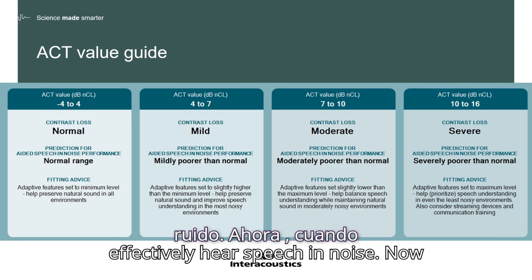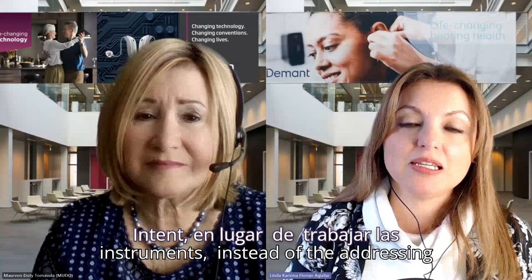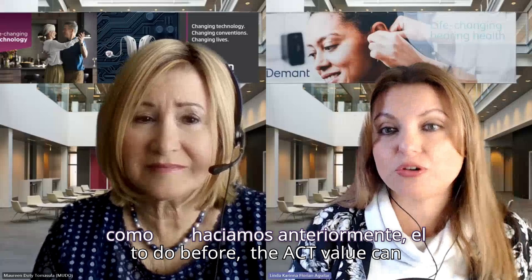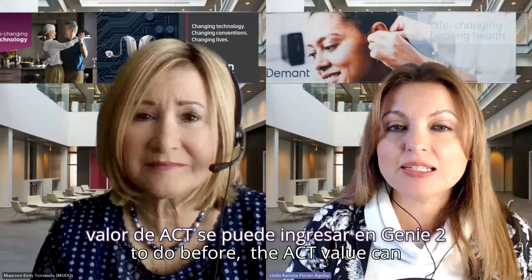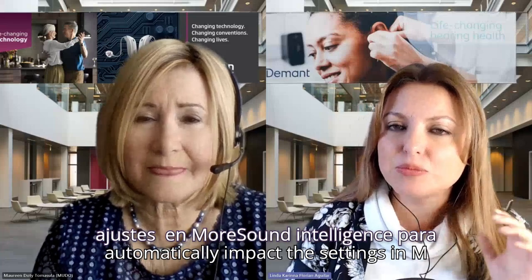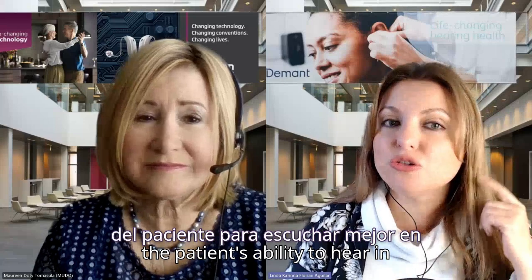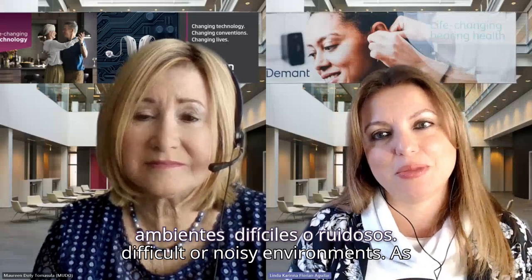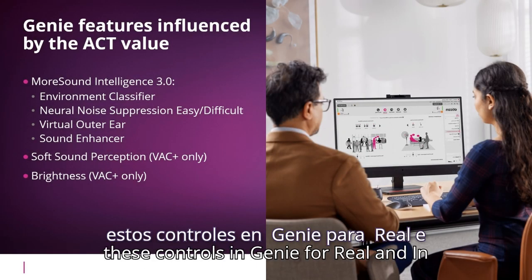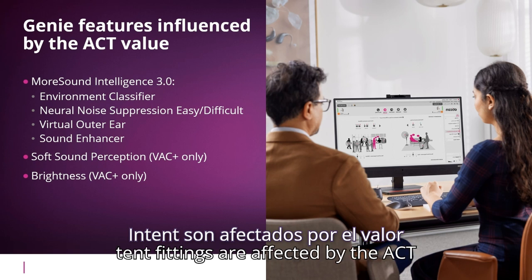speech in noise. Now, when fitting Oticon Real and Intent instruments, instead of addressing the personalization questions as we used to do before, the ACT value can be entered into Genie 2 and will automatically impact the settings in MoreSoundIntelligence to better support the patient's ability to hear in difficult or noisy environments. As you can see on the slides, all these controls in Genie for Real and Intent fittings are affected by the ACT value.